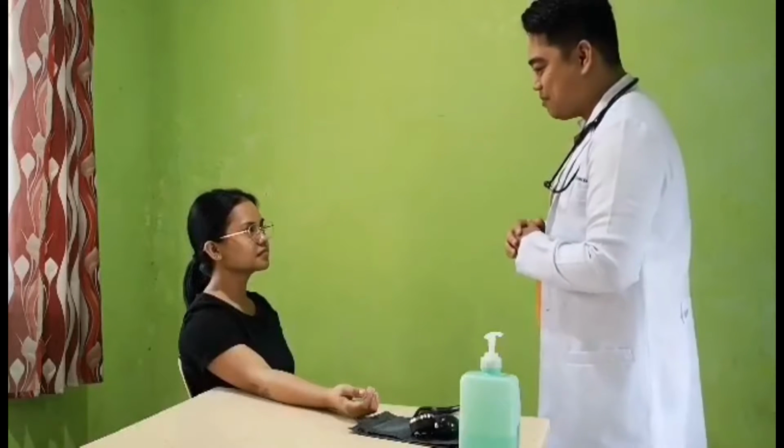Hi patient, I am Dr. Akain. Today I am going to monitor your BP, and this procedure will not take too long, and this is also not a painful procedure. So patient, please state your name. I am Kadikit Asadaran. I am 22 years old.